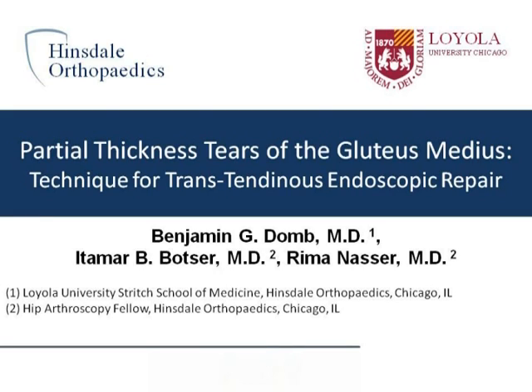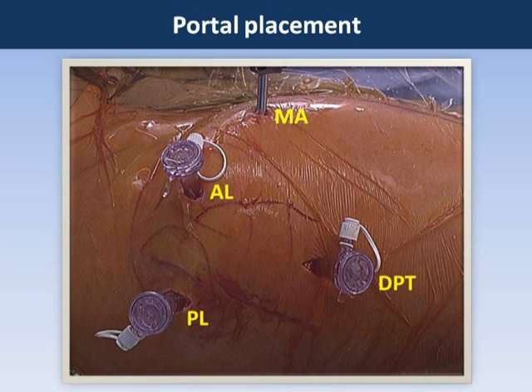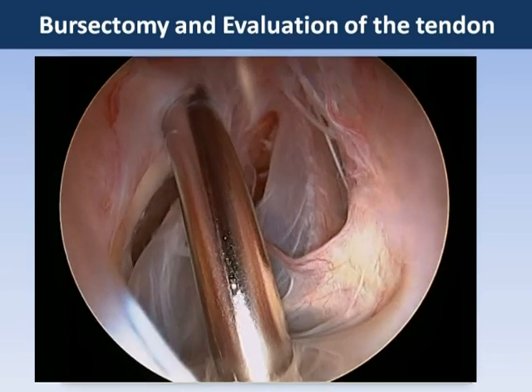This video demonstrates a transtendinous endoscopic approach to repair of partial thickness tears of the gluteus medius. We begin with a fluoroscopic insertion of the cannula and use four portals: an anterolateral, posterolateral, mid-anterior, and distal peritrochanteric.